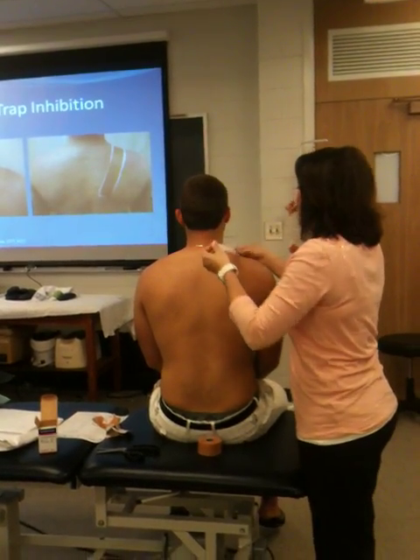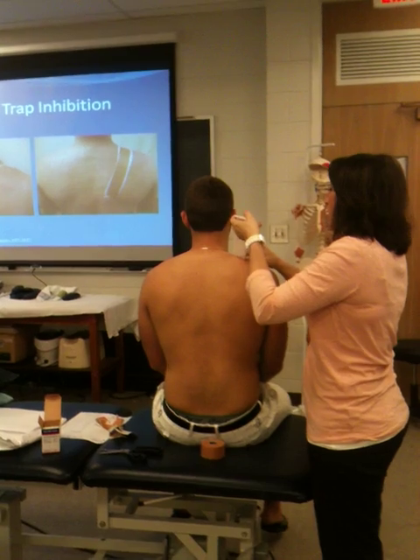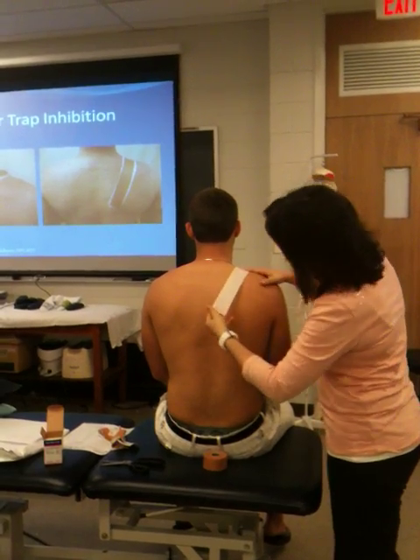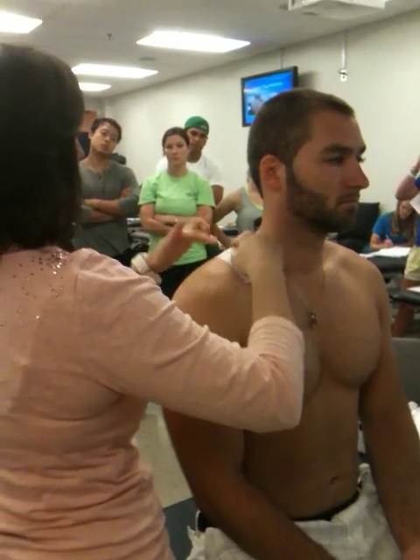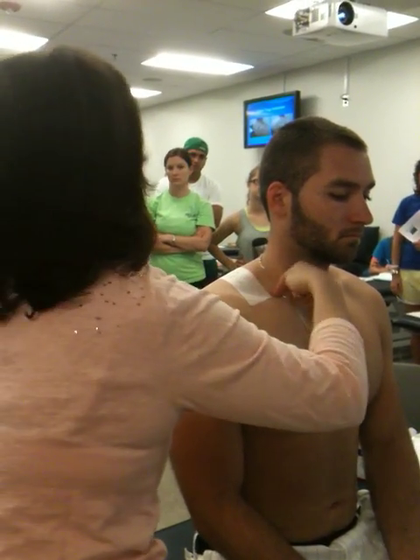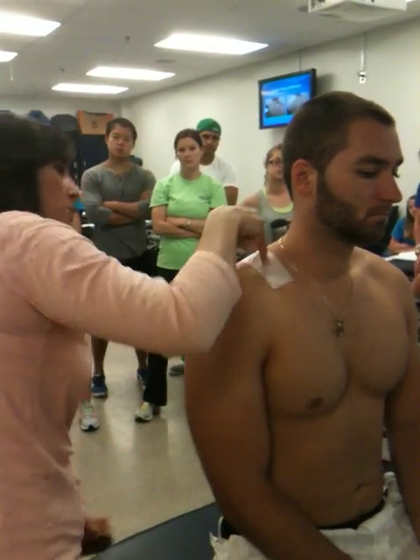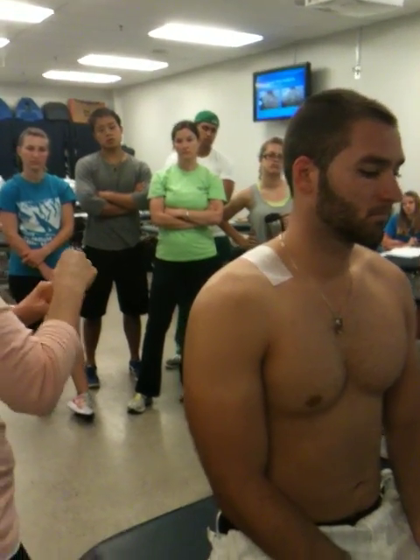So you're going to, again, come to the anterior portion, beyond the muscle belly of the upper trap, onto the anterior clavicle. You're going to anchor again, and this time we come down over the upper trap. Now you can put this piece wherever you think you need it. If it's more lateral upper trap that's tonic, if it's more medial upper trap that's tonic, or it's right in this belly, right where the first rib is. Imagine the first rib is right here, tucked away under the clavicle. It's underneath this tissue right here.